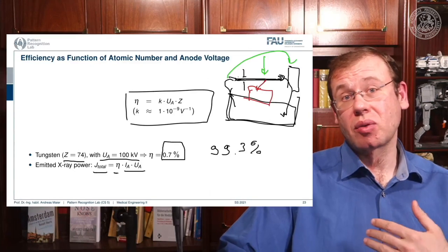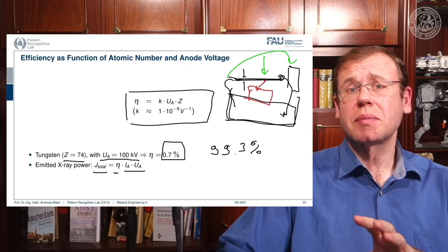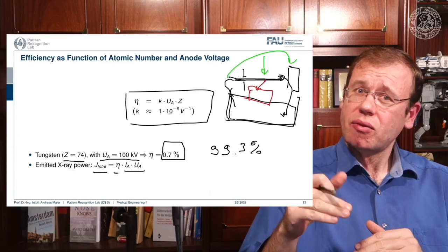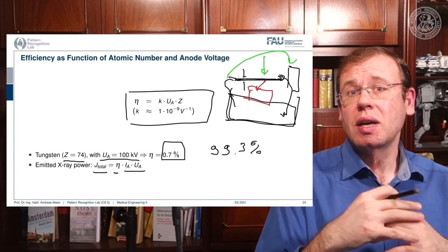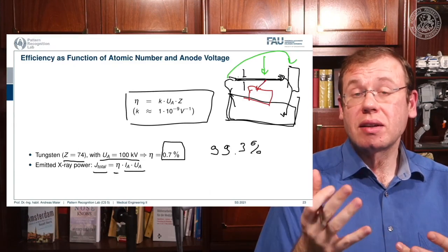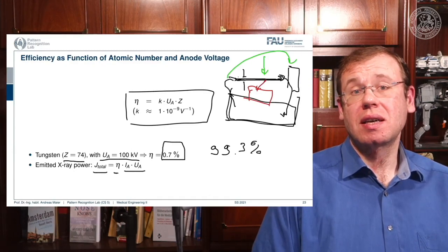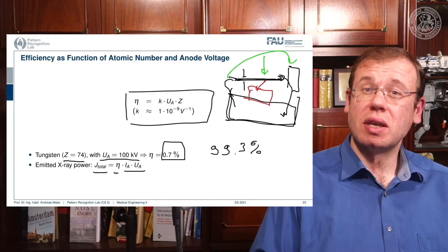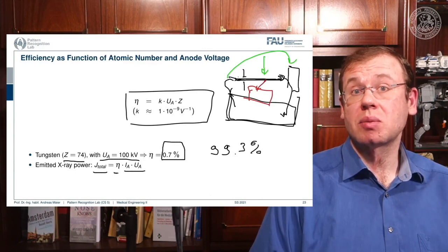This is research, but you already see now that the kind of things that we are doing here in this class, they're not just a basic introduction, but we also want to show you that everywhere in these modalities, it's not that far actually to go into a research direction. And now this is a research direction into the actual generation of the X-rays, so it's not like we discovered this more than 100 years ago, and still there are new breakthroughs that are being discovered more than 100 years after the discovery of X-rays. And you will also see that when we look then into the developments of CT, that there is a continuous trend to improve image quality, to use less photons and so on in order to get the best image quality possible for the diagnosis.